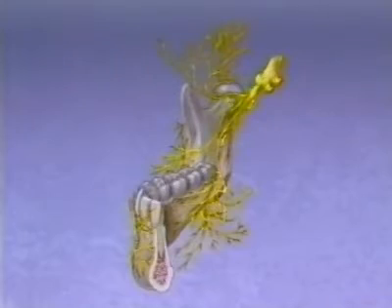muscle. In contrast to other intraoral nerve block techniques, this point is at least 1 centimeter away from the nerves of interest. Therefore, medial, anterior, and inferior distribution of the anesthetic agent within the pterygomandibular space is essential for anesthesia to occur. The Gow-Gates injection is the closest intraoral technique to a true mandibular block. In addition to the inferior alveolar and lingual nerves, the buccal and auriculotemporal nerves are often blocked, the buccal nerve approximately 70% of the time.